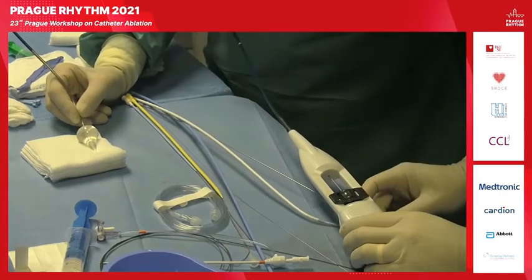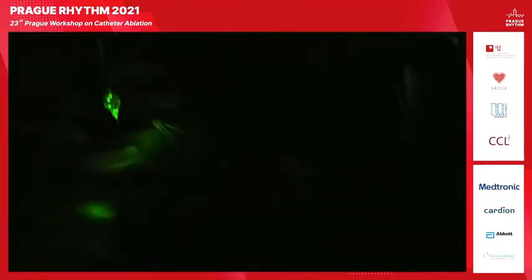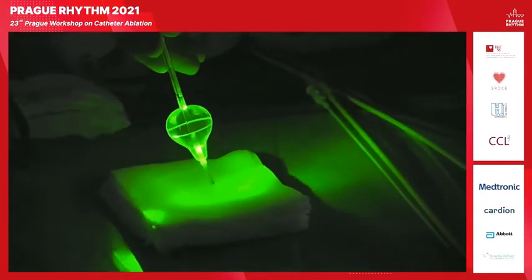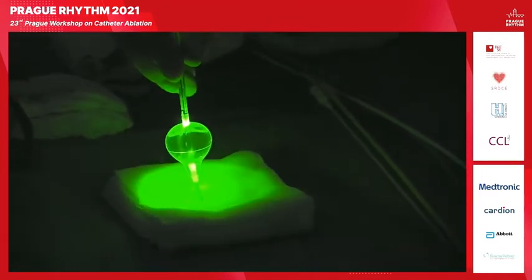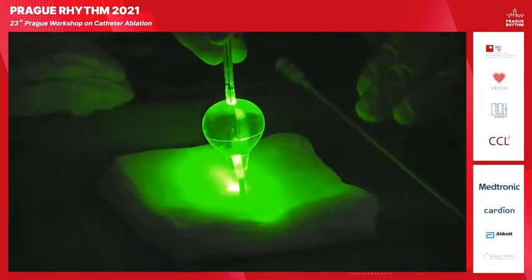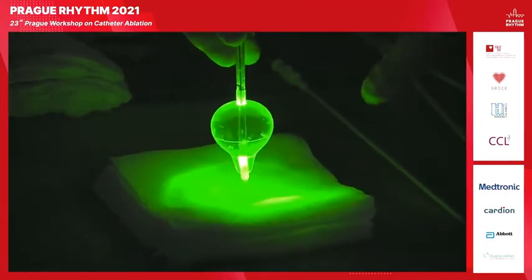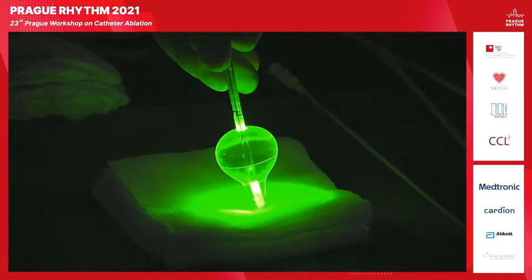So we will show you, please can you give me the green light? And guys, can you get the lights off a bit? Okay, this is visible, the balloon inflated. Actually the balloon size is up to 38 millimeters. I don't want to get the biggest size, but what I want to show you is the nicely controlled rotation of the laser beam, which is now green light and it's not dangerous, so we can just visualize only. And Honza will rotate continuously to mimic the automated rhythm of rotation.